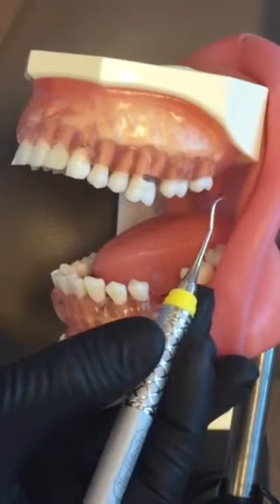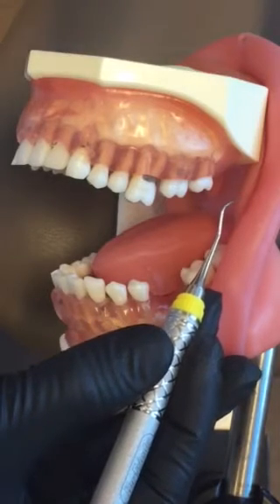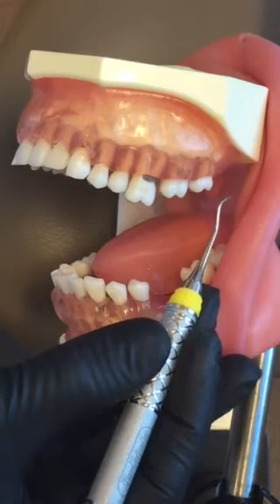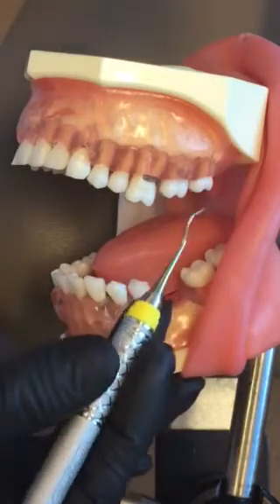This is your Columbia 13-14 Universal Curette. It's universal, meaning you can use it both posterior and anterior on all surfaces. I'm going to show you on the upper left buccal.